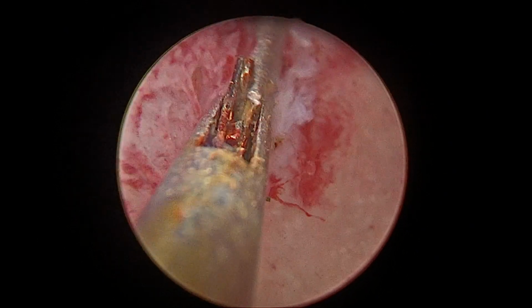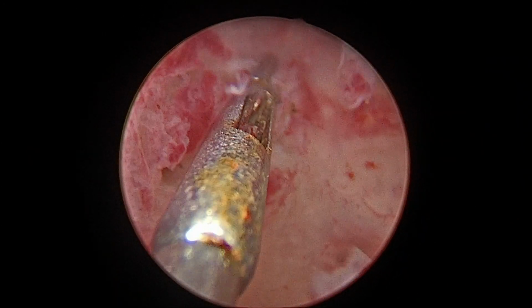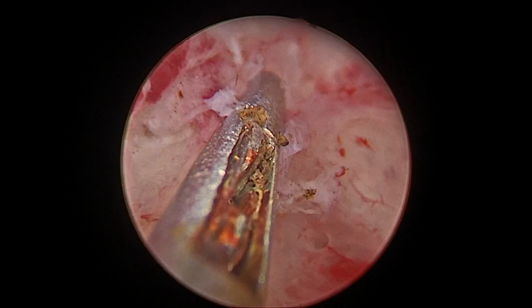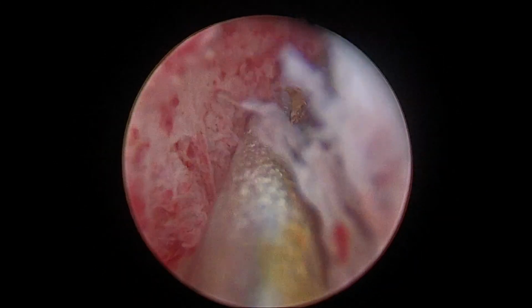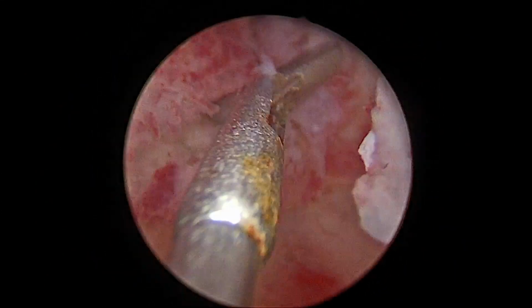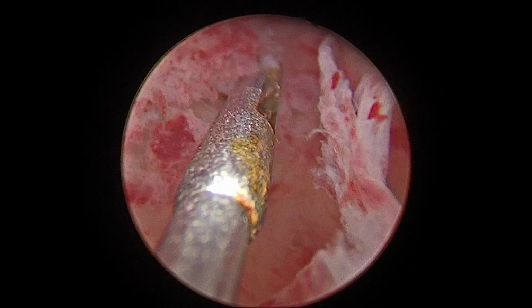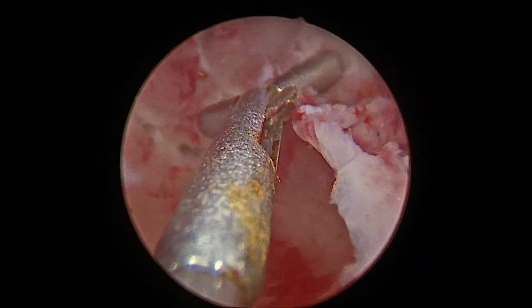In this patient, the copper T was kept inside the uterine cavity 10 years back and it was later removed. But a piece was left behind, and she found out only when she had abdominal pain. It is doubtful whether this piece of copper T was the cause of her abdominal pain, but when she found out that it was there, she was worried. So we removed it hysteroscopically.